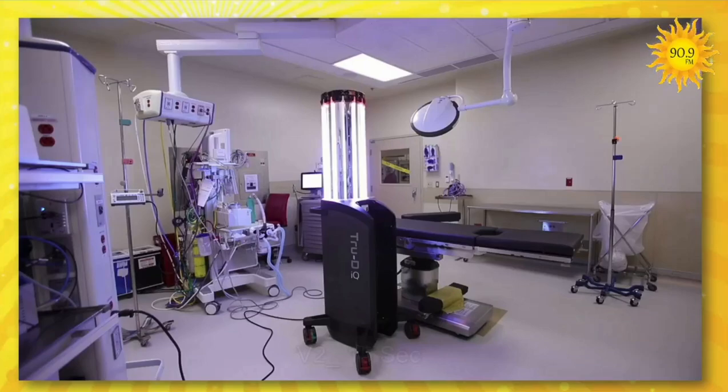Diff, MRSA, COVID, and the housekeepers, they go in there, they don their PPE, terminally clean it, which is mopping the walls. That personal protective equipment, that PPE, right? Right, PPE, I'm sorry, personal protective equipment. It's been a while since we heard that term during the COVID years. We heard it all the time, but just to remind everybody. Yeah, and it's just second language to us in healthcare.